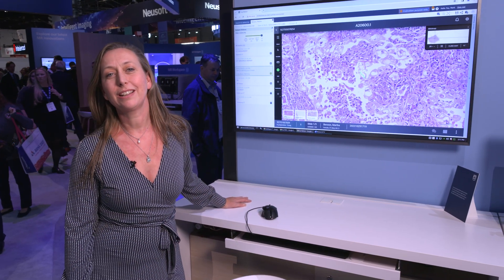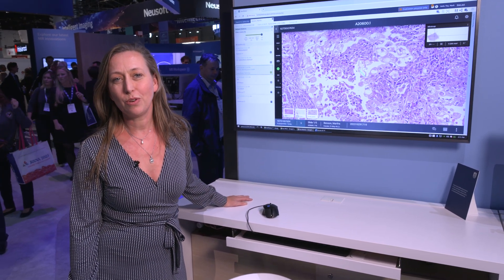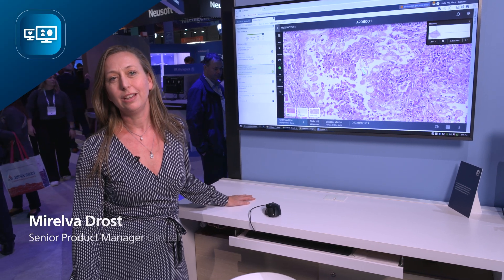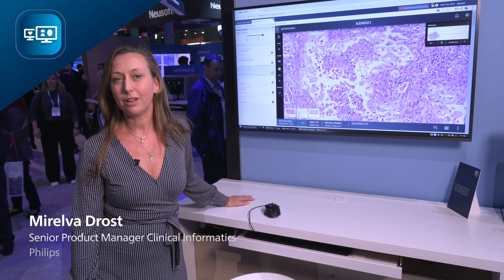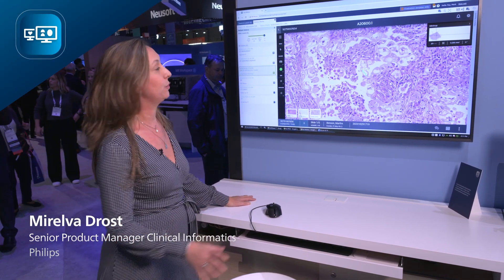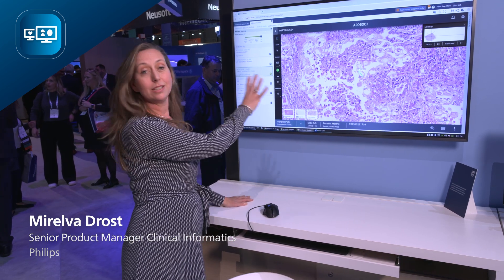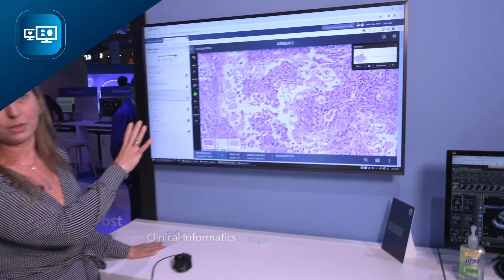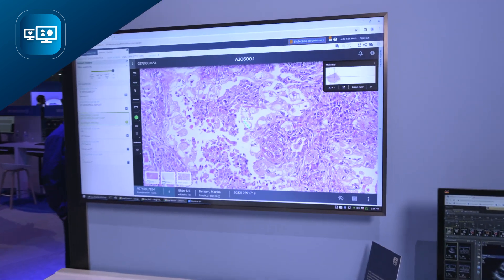Hi, I'm really excited to show you how we onboard digital pathology in the Enterprise Imaging platform. Let me show you. This is the Enterprise Viewer, the Philips Enterprise Viewer.